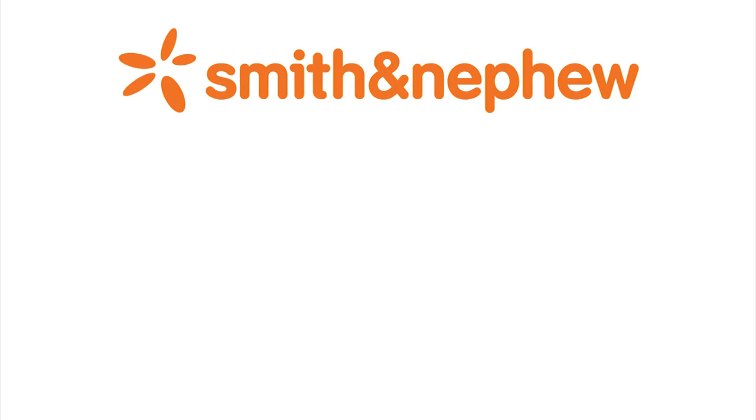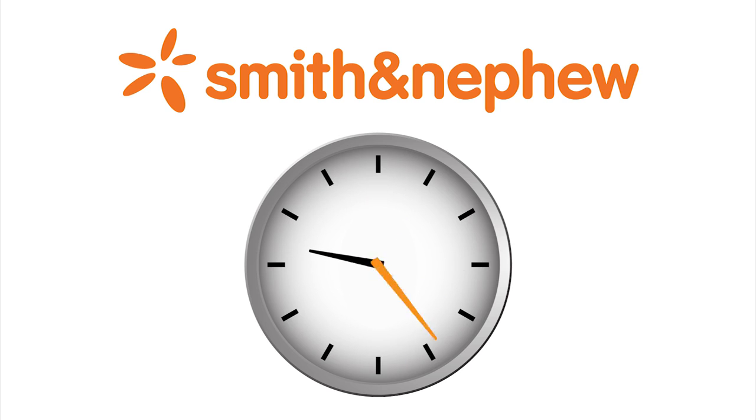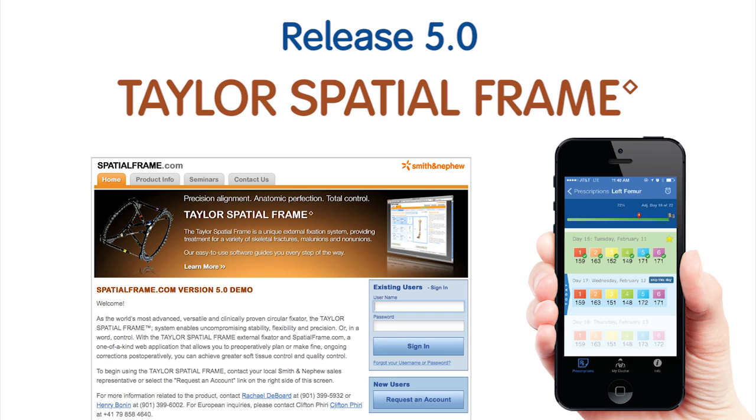We at Smith+Nephew know how valuable your clinic time is, and we hope that the features introduced with the release of 5.0 will help you to better manage your TAYLOR spatial frame patients.